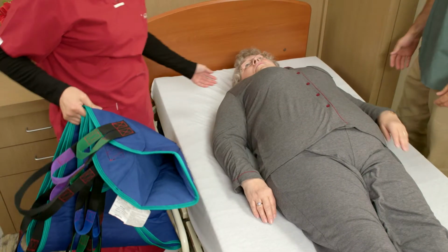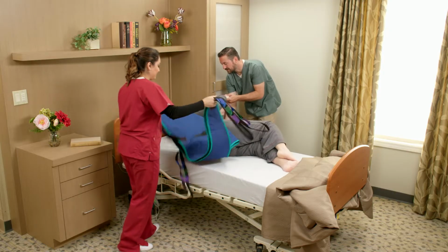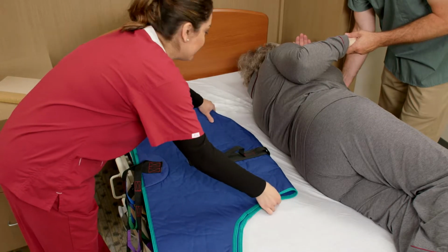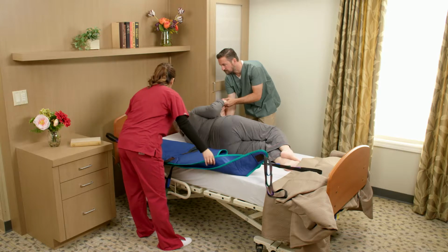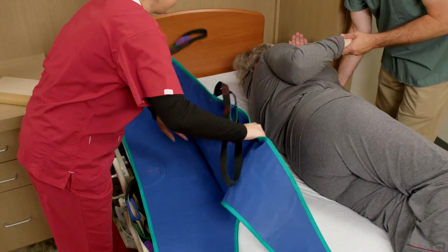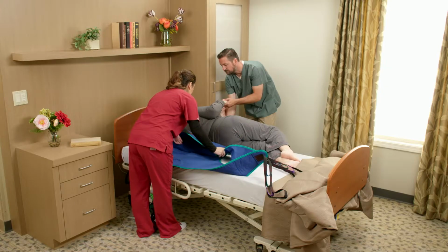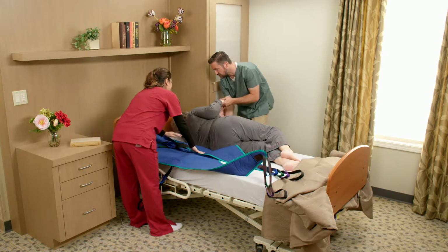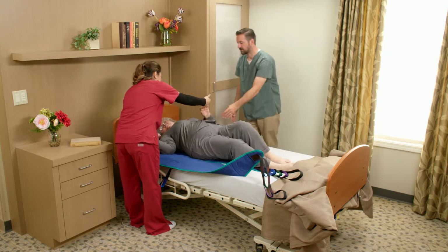First, position the resident in the center of the bed, lying flat on his or her back. Fold the sling in half, lengthwise, and place the sling beside the resident. The closed end of the sling with the positioning handle should be facing the resident when folded. The top edge of the sling should be slightly above the resident's head. As necessary, help the resident roll from back to side. With the resident on his or her side, position the sling so the fold will align with the resident's spine when he or she returns to lying flat on his or her back.